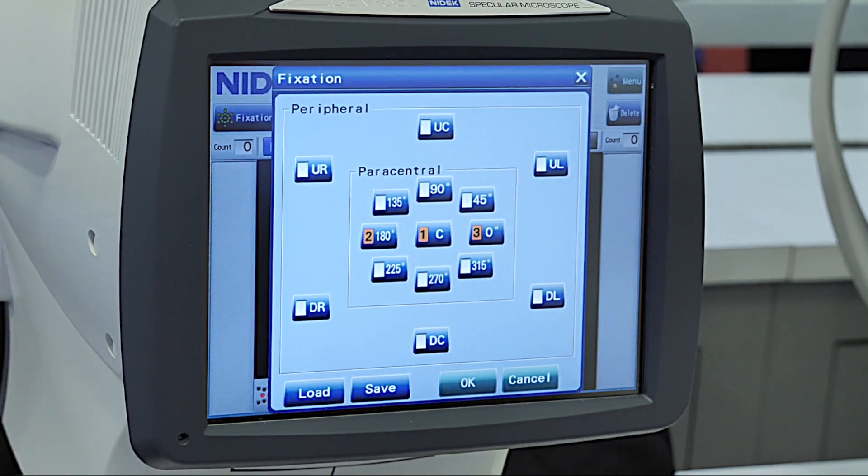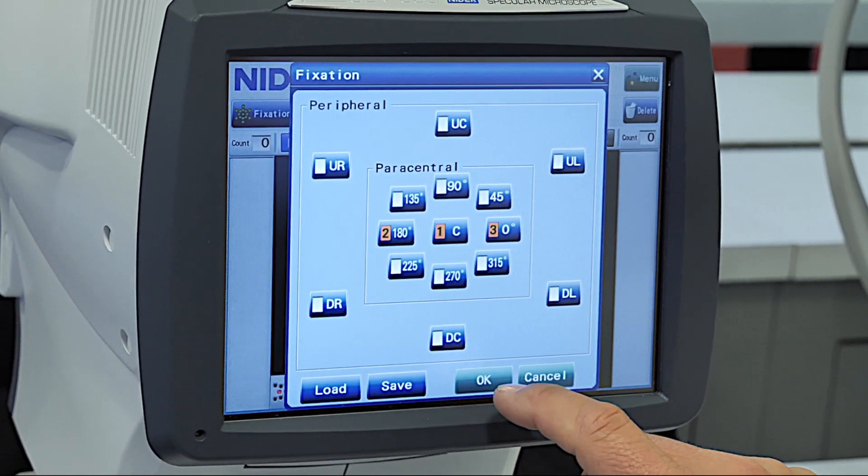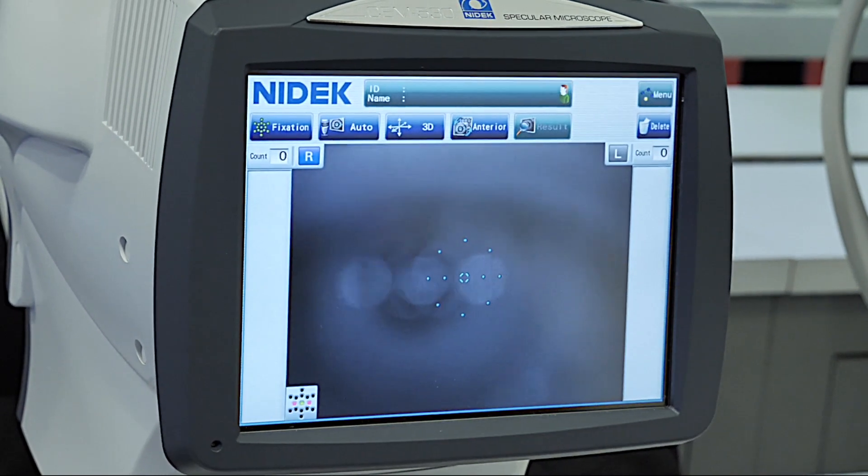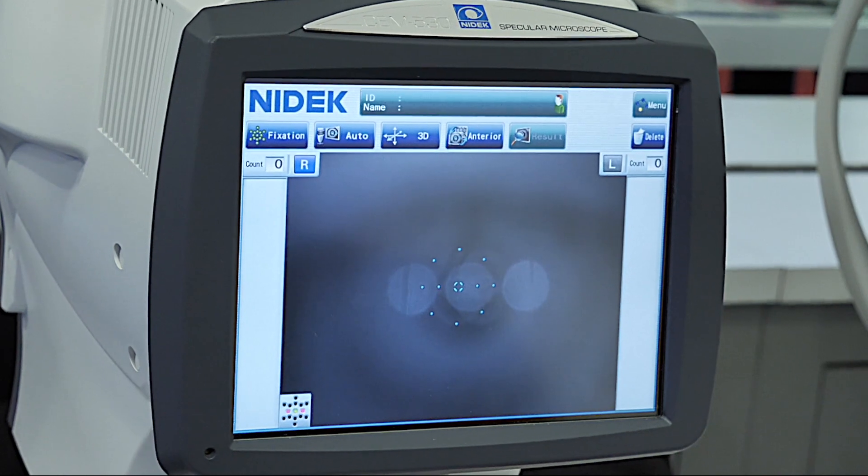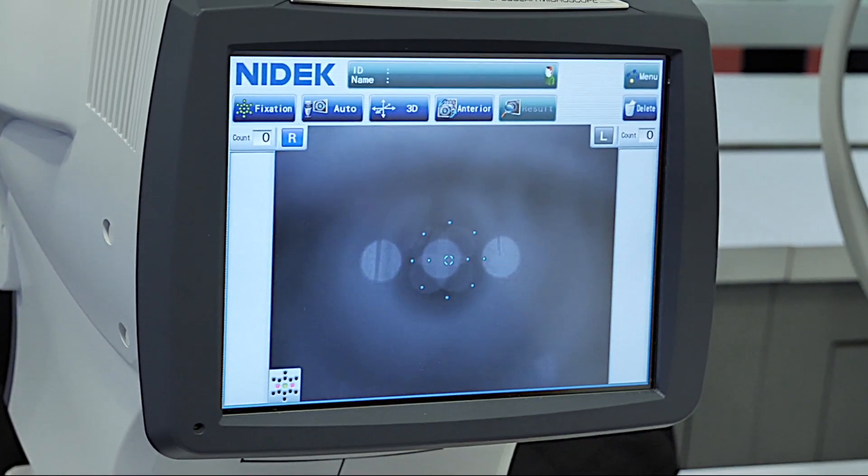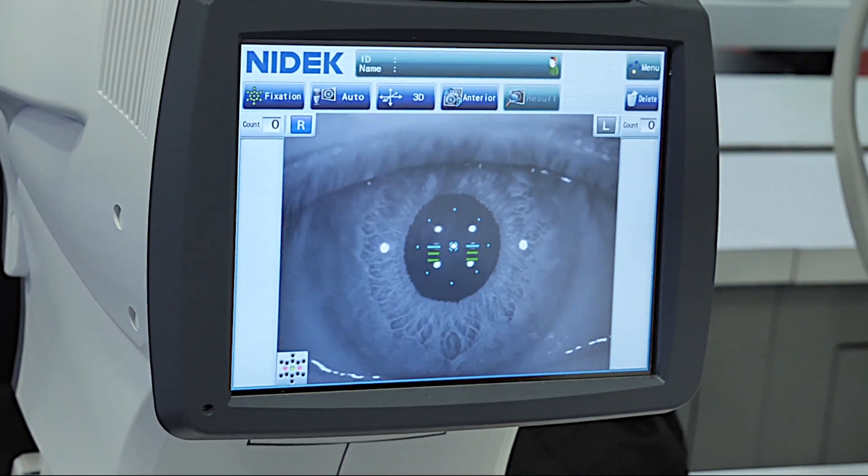At this point I'm going to show you how easy the device is and how the auto-tracking function works by selecting three fixation points. It is easy to use. It has auto-tracking on the X, Y, and Z axis and alignment. It also has auto-shot. So all you need to do is push the device in. It will take over.